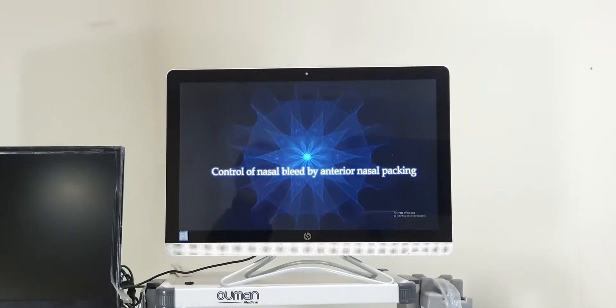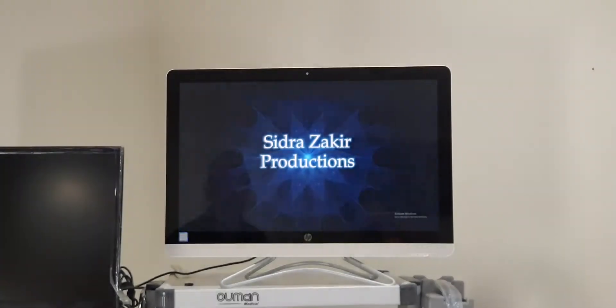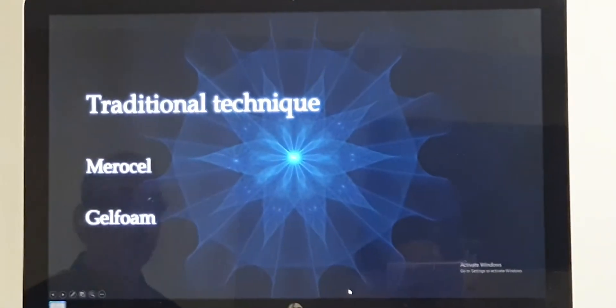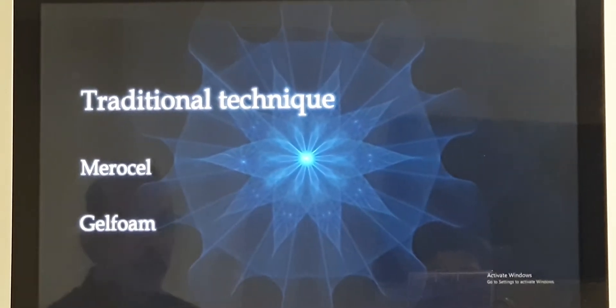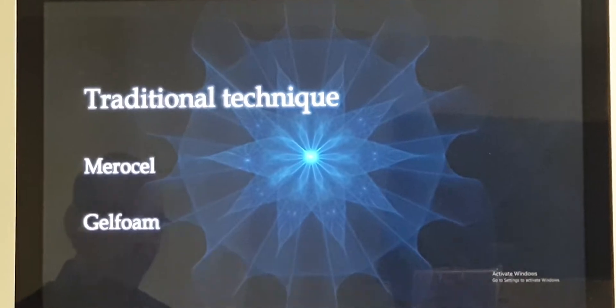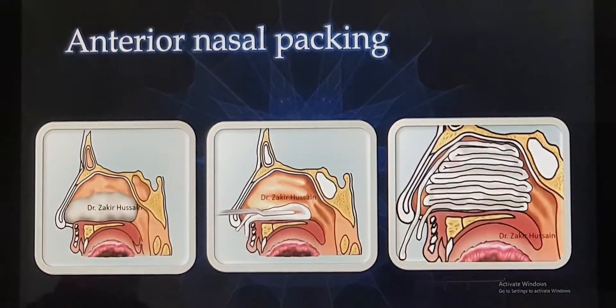The indication of anterior nasal packing I have already told you. Coming to the technique, we have three methods: either the traditional technique, or we can insert a Merocel pack (in India we call it Avalon pack), or the third option is Gelfoam. First let us go through the traditional technique where we use long ribbon gauze.